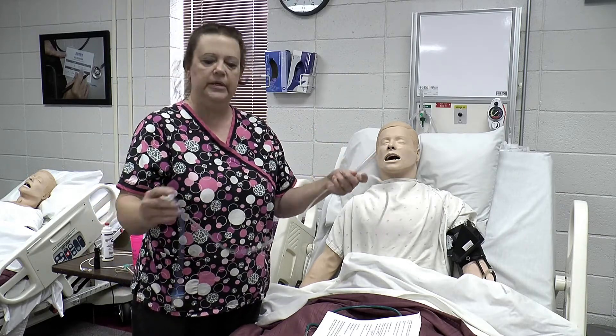When we get ready to do this, we have our water and our towel, and we want him in an upright sitting position — not lying down, all the way up. Move the pillow a little bit because we are going to have him hyperextend his neck backwards, and then we are going to tell him to put his neck forward as we are going down with the tube. Remember, we measure nose to the ear and down, and I have my tape marked. Be sure to put your KY lubricant on the tube.